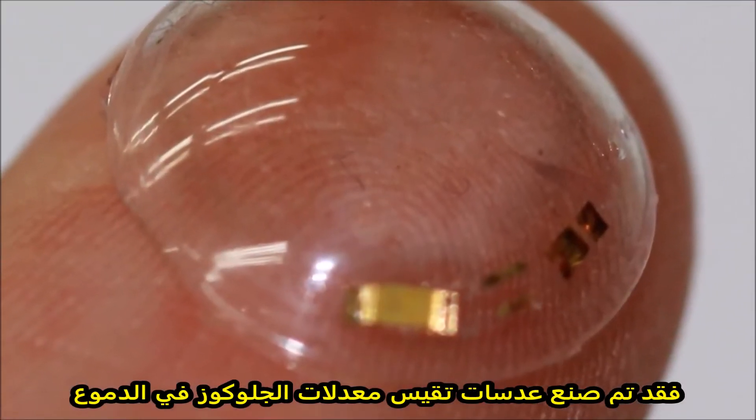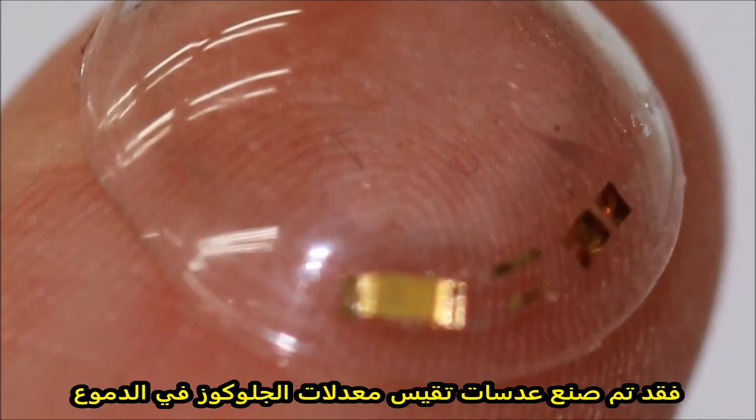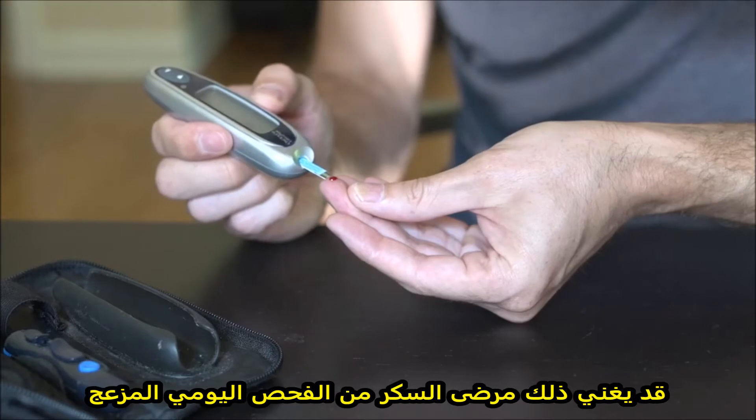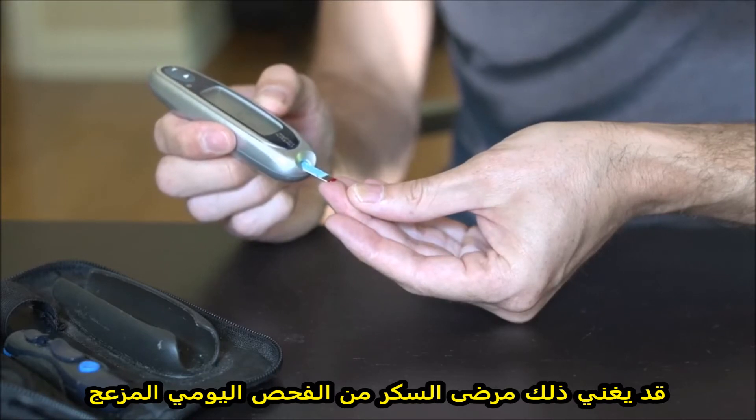Researchers have created a contact lens that monitors glucose levels in tears and signals via an LED light. This could help diabetics do away with painful daily blood tests.